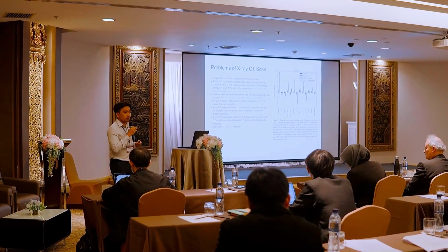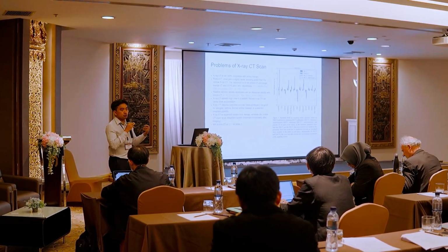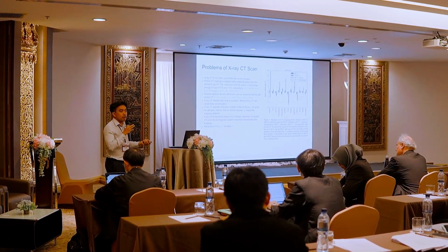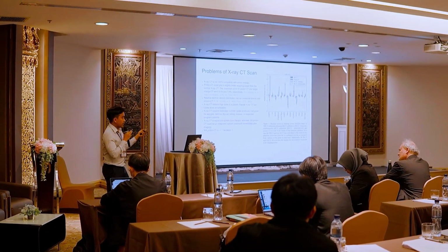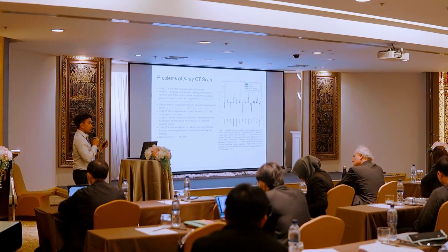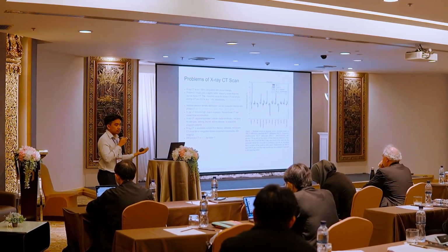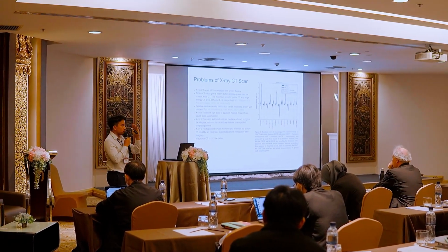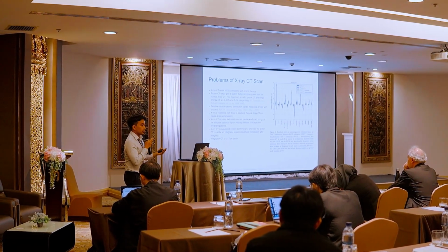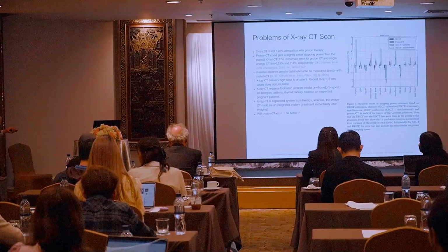This means it's also possible that we can have an integrated system. You imagine your patient's body scanned some minutes, some hours just before the proton therapy starts, right? This would be good. I mean, at least there is less chance that the tumor or cells move, or the patient's body changes, or the location of the cancer changes. I don't know, but okay.